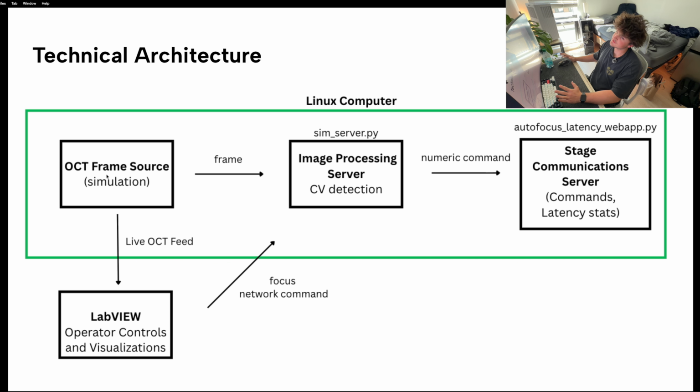In our case right now, it's a simulation. In the future, it'll be a live source. This communicates directly with the image processing service. Computer vision lives on there. Once that processing has been completed, a numeric command is sent over to the stage communication server. And that's how we receive latency stats, how we make everything move. All of this lives under the Linux computer, right?